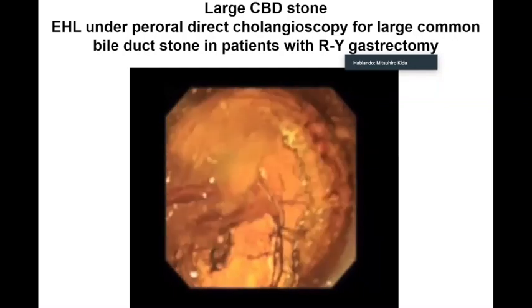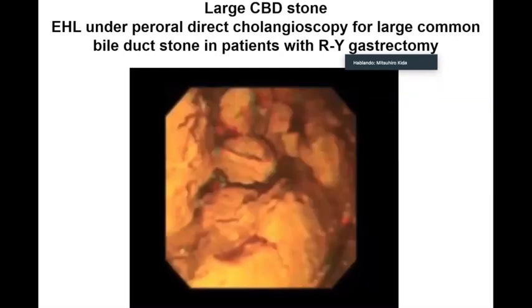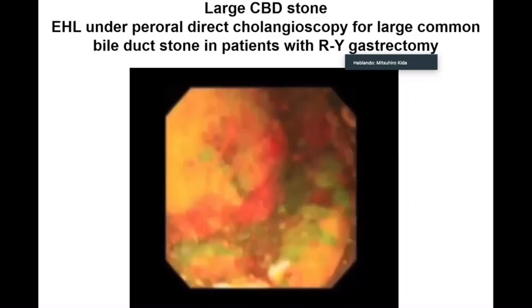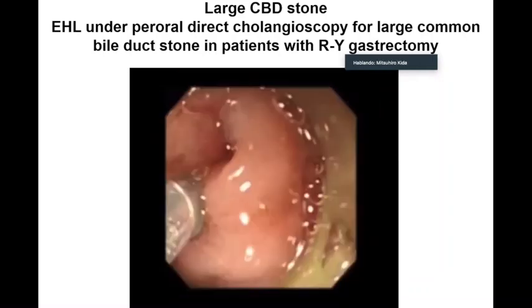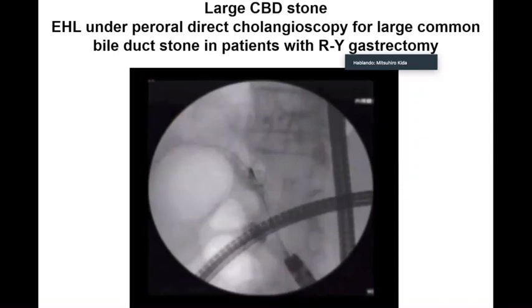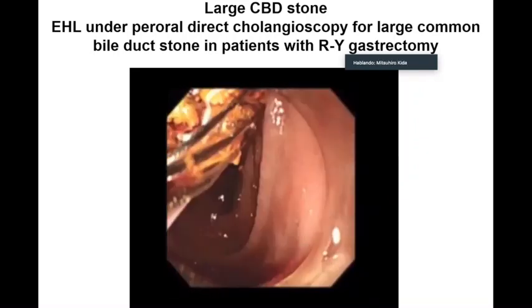So using the small bowel enteroscopy, sometimes we can treat the bile duct stone in one session, even though the stone is very big. That is also a problem.